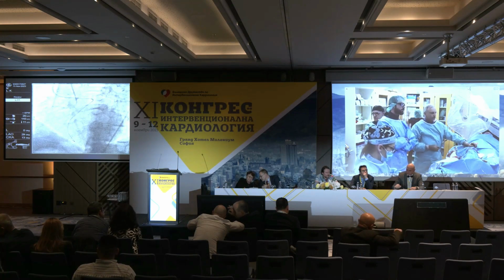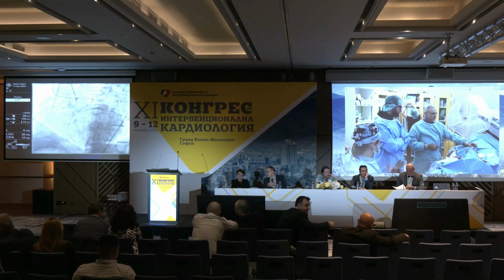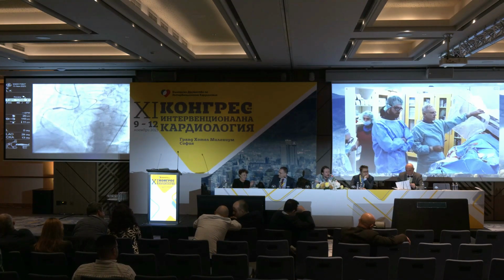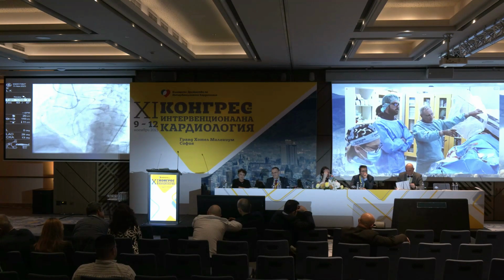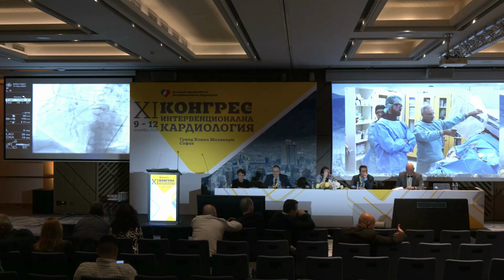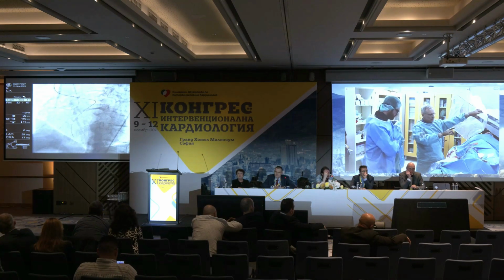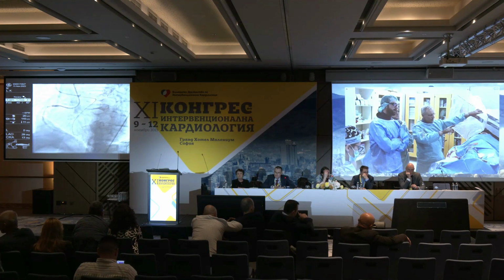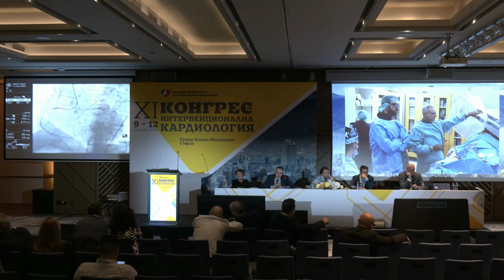No, thank you for this. We were rushing in our decision making. We were happy with our success, but the details and the specifics of the procedure will not be clarified until we have this IVUS. And of course, I have a 6-French guiding catheter. There is no damping. I don't know if you can see my pressures. Do you see the hemodynamics of the patient or not? Yeah. So this 6-French guide in the ostium is not causing any pressure drop. There is some backflow, but it's obvious that the ostium is also not normal, and this is a big vessel.